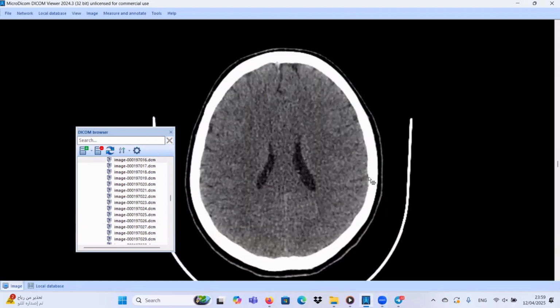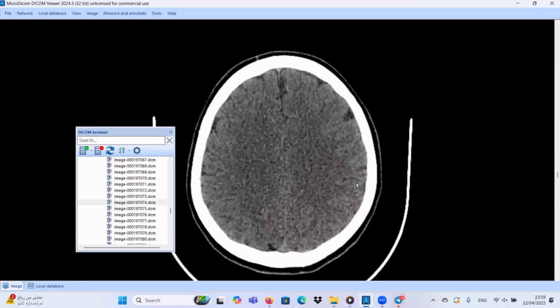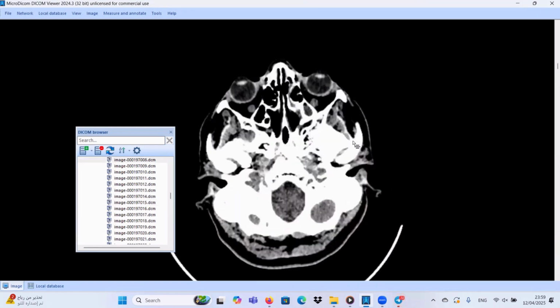Let us continue our course. And as we said in the last video, the best way to finish our course is to highlight the importance of the CT brain checklist.